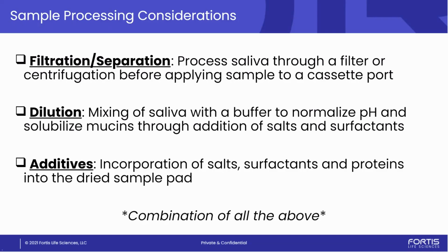A lot of the markets for that where the saliva is so valuable is in that OTC space. Asking patients or users in the field to take 2 drops from your saliva or take that swab, mix it into an extraction buffer, pull out the swab, and drip that in, very similar to a COVID test, is possible. And that would be the consideration initially. But again, that's not fixed volume, right?